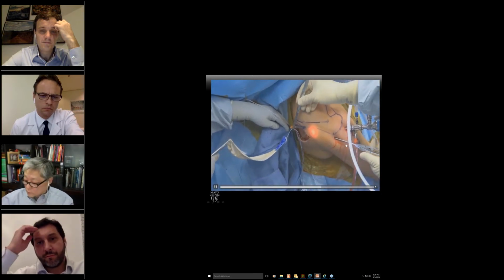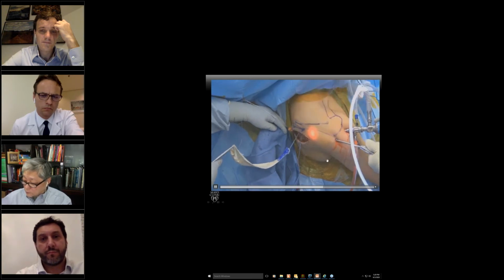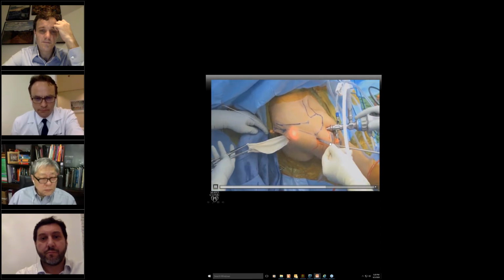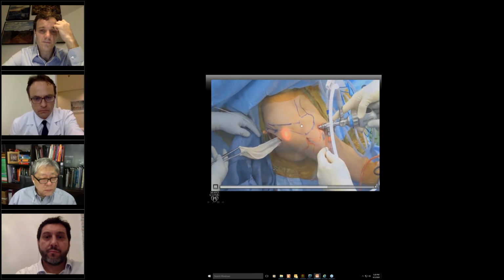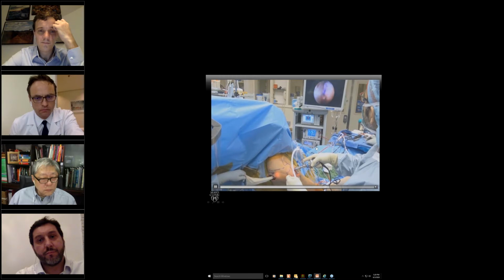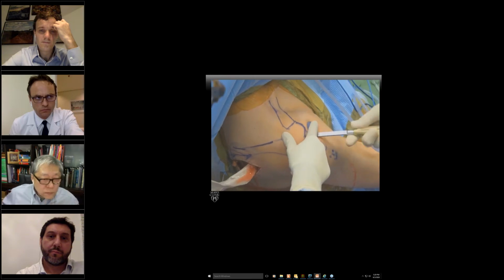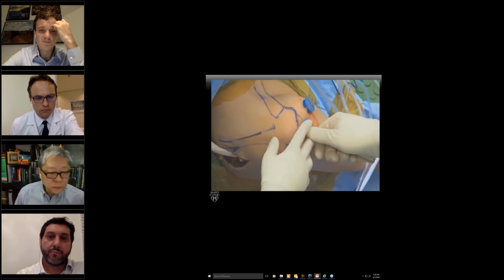And I usually use this large grasping clamp. There are a lot of techniques to pull this tendon in, but this is the way I do it. There are a lot of modifications now because surgeons are more and more doing this surgery. And I pull the sutures from the posterior portal. But it depends where you want to attach your tendon. If you have infraspinatus only, I attach it on the lateral aspect of the infraspinatus footprint. If it is a posterior superior rotator cuff, I attach it to the anterior footprint of the supraspinatus, and I'm going to show you this as well.